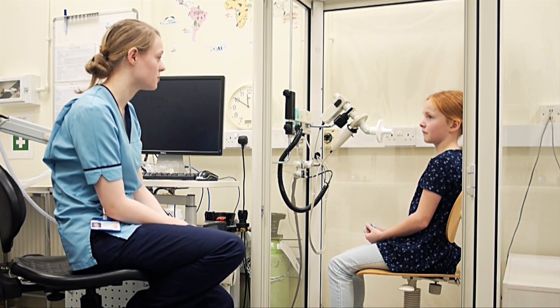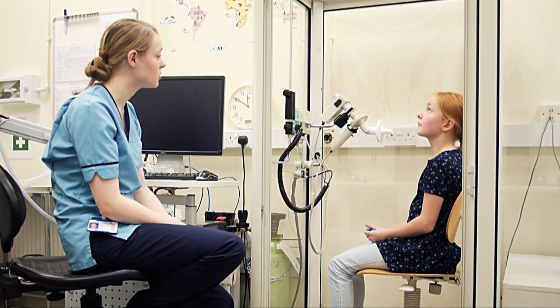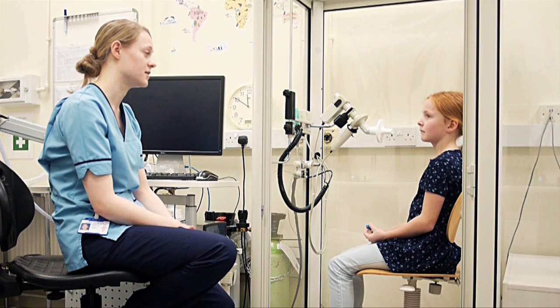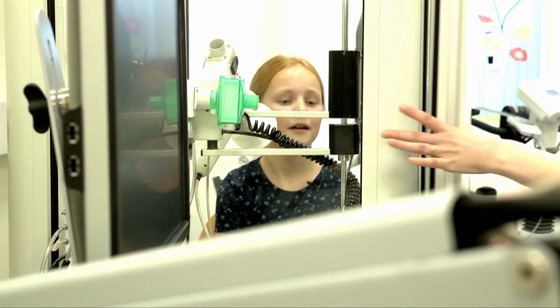Sometimes it gets quite warm in the box but we'll try not to have you in for too long. There's a microphone up there so you can hear me talking to you, but you might need to shout quite loudly to talk back to me.